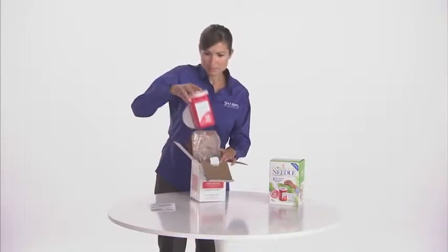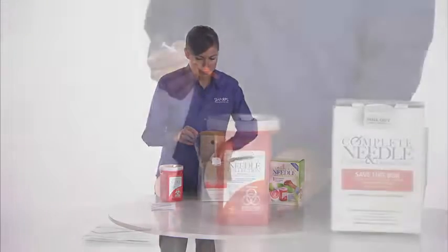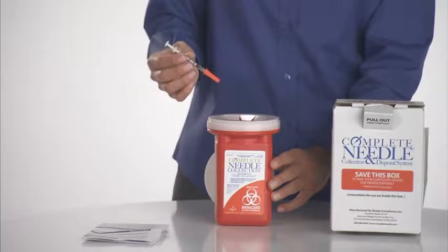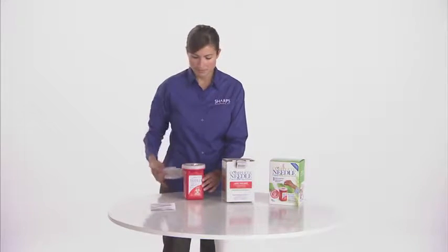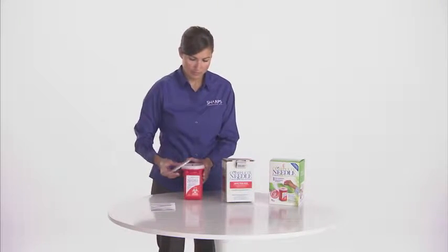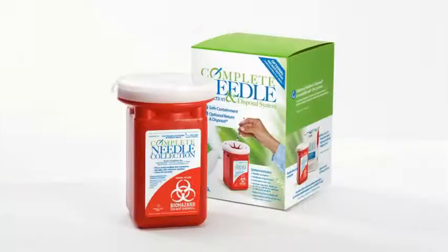Place the sharps container in a convenient location and keep it away from children and pets. Place your used lancets, needles, and syringes into the container. We recommend that you keep the lid closed when the container is not in use, and be sure not to ever overfill the container.